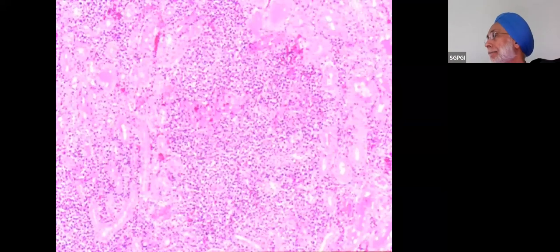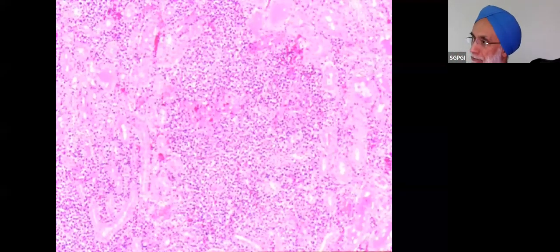And yes, PTLD. Whenever you have a biopsy which is blue, most of the time it's going to be rejection. But every day you have to at least keep PTLD in the back of your mind, because otherwise the day PTLD comes, you're going to call it rejection. And that's not going to be good for your reputation.